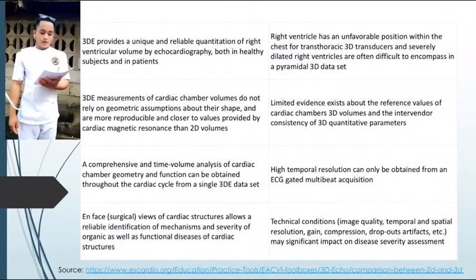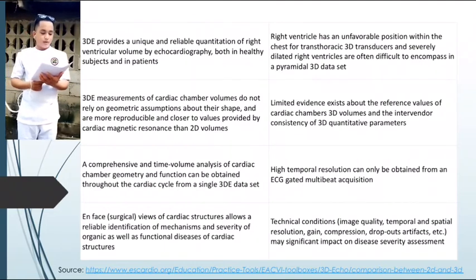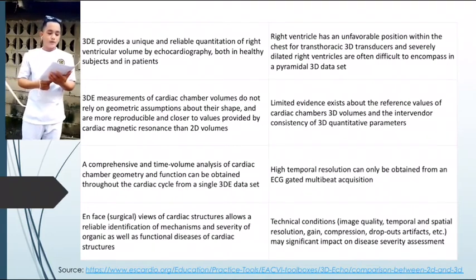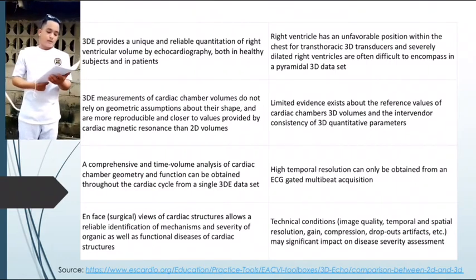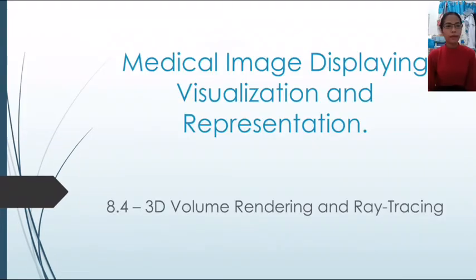High temporal resolution can only be obtained from an ECG-gated multi-beat acquisition. En face surgical views of cardiac structures allow a reliable identification of mechanisms and severity of organic as well as functional diseases of cardiac structures. Technical conditions, image quality, temporal and spatial resolution, gain, compression, dropouts, artifacts, etc. may have significant impact on disease severity assessment. And that's all.